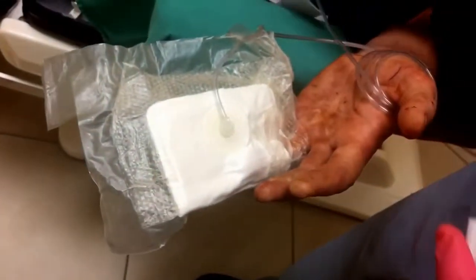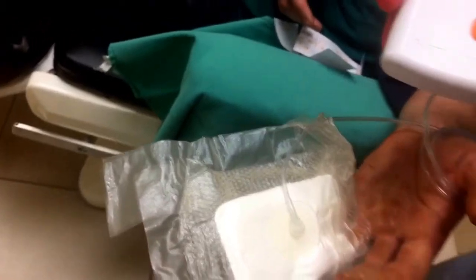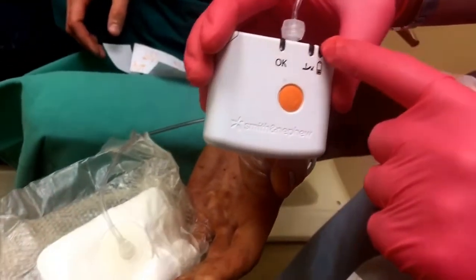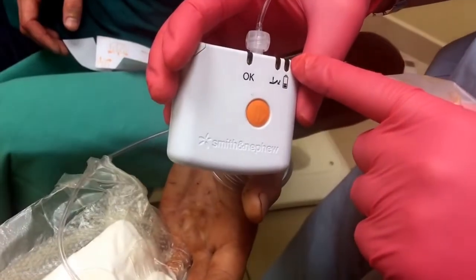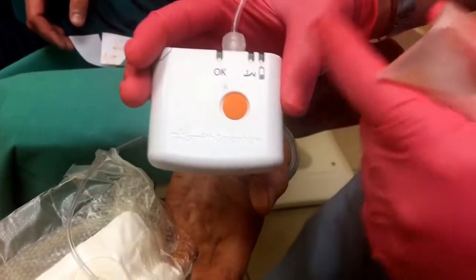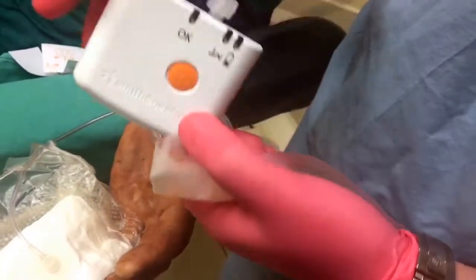Okay, so that is the Pico — you can see it's functioning. The green light is on. If it was not functioning, the orange light would be on. If the battery is dead, the red light goes on. That's how he knows — if the batteries go dead, you can just change the batteries right in here. And that's it.